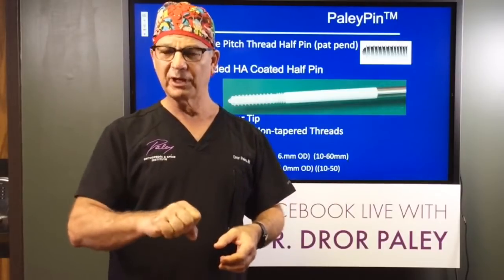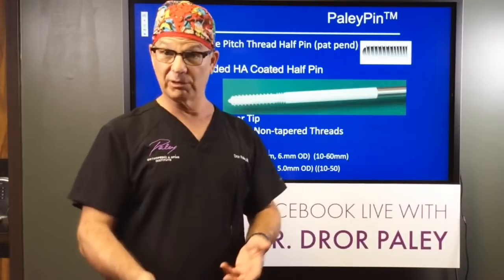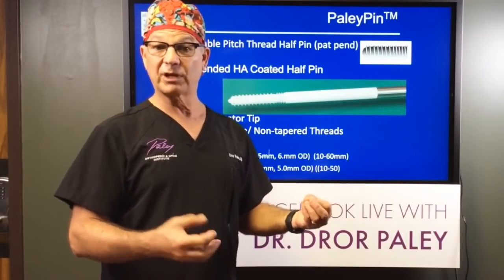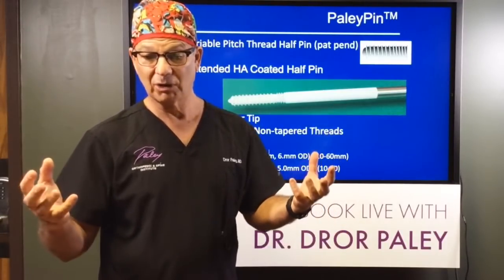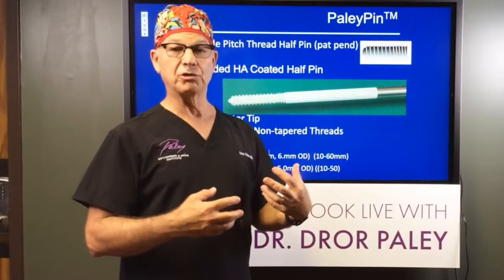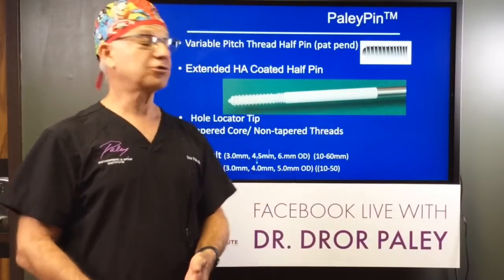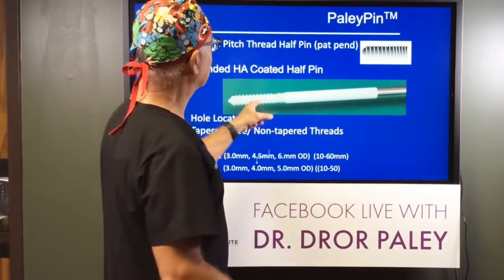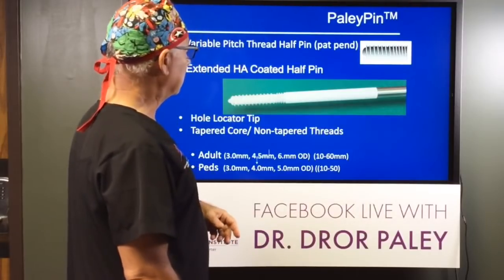Okay, let's move away from external fixation. External fixation is the way this was all done for limb lengthening since 1903, until you're going to see 1983. After that, people started thinking, could we lengthen with devices on the inside of the body? So let's look at a little history.